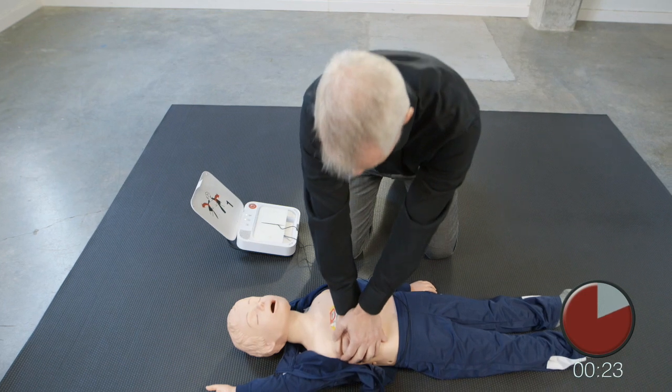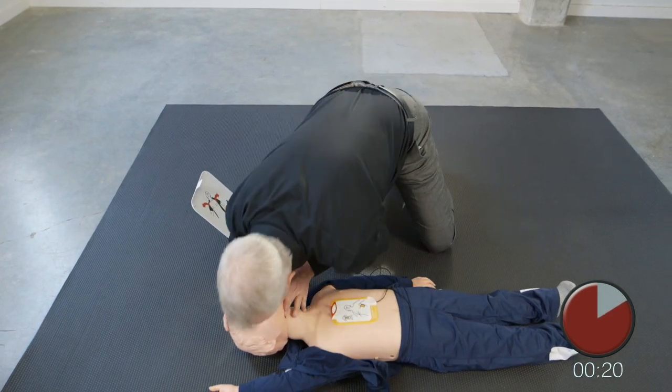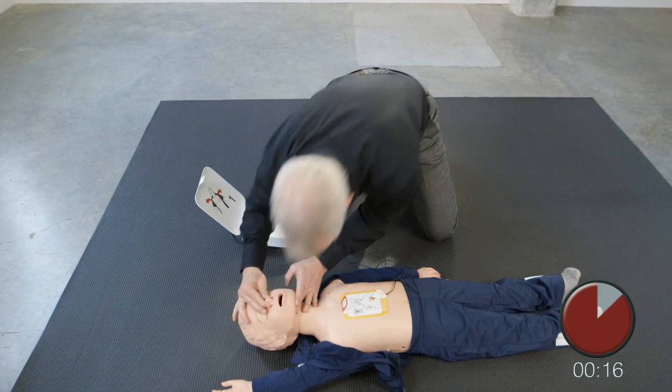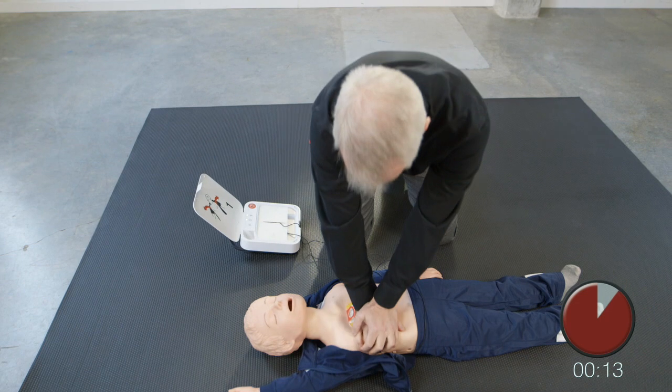Provide two breaths. 1, 2. Resume chest compressions. Push down deep.